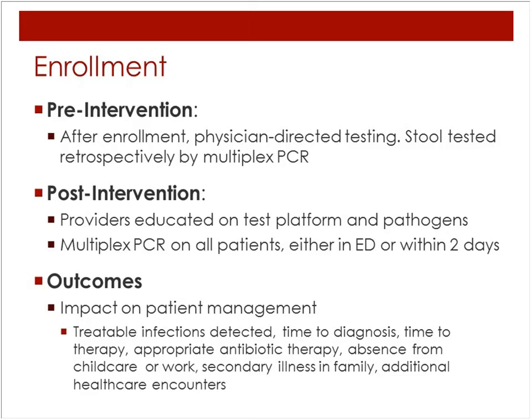In the post-intervention phase, prior to implementation, the providers were educated on test platforms and the pathogens that were included in the GI panel. They were also given a link to an educational website that provided information about each target that was included in this panel. Once the FilmArray GI panel was implemented for the study, patients were enrolled in the ED or within 2 days of presentation, and the GI panel was performed free of charge in real time, with the results being reported into the patient's medical records.